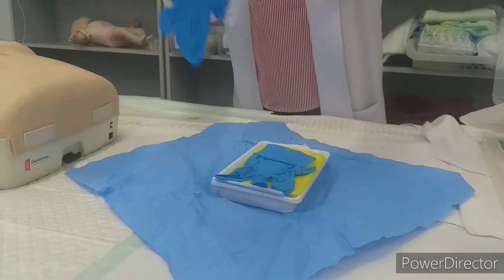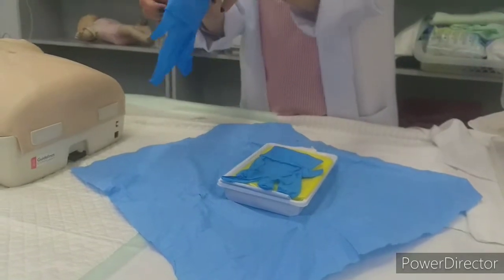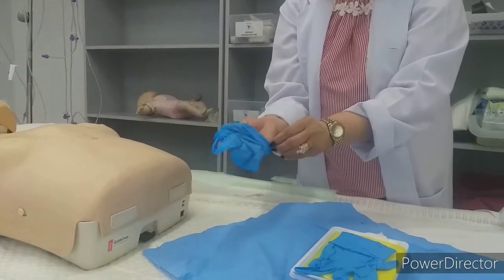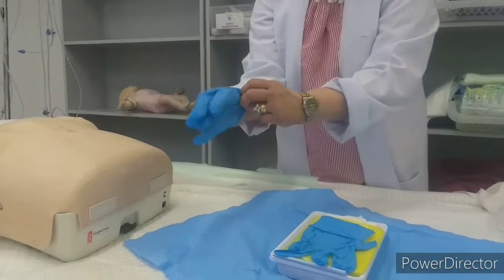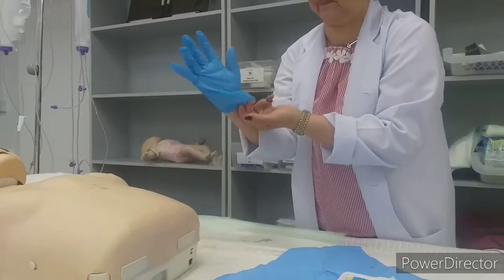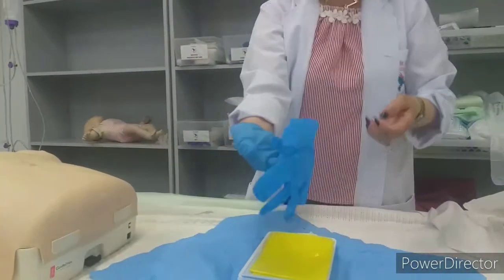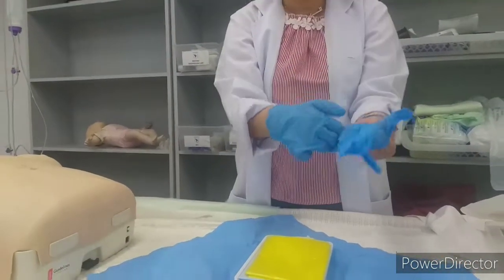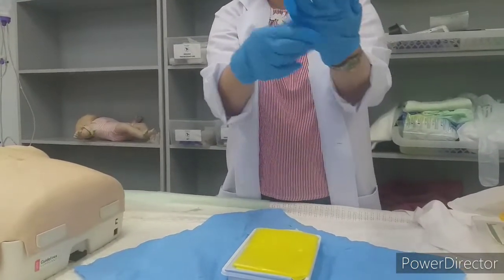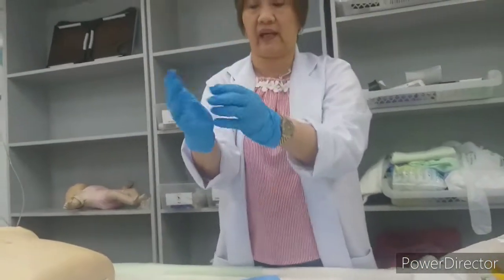Lift, okay, palm up, insert, okay, fix it from under, up to your wrist, scoop, palm up, insert. You can fix it now from here because both are sterile now.